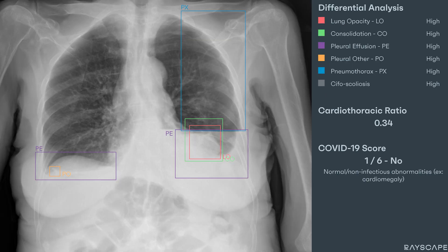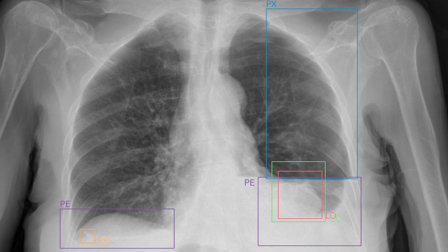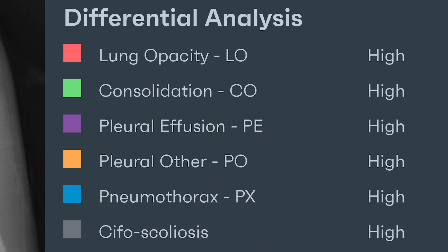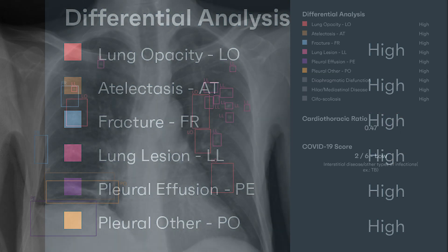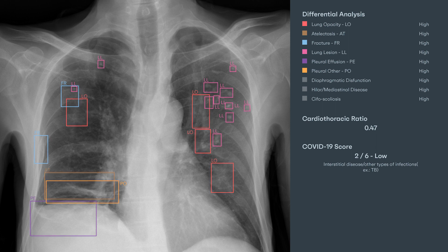Rayscape's AI algorithms can detect 148 anomalies on chest x-rays, including pneumothorax, pleural effusions, lung nodules, and fractures. Those pathologies are grouped into 17 different classes and localized on the image, helping the radiologist to output faster, precise results.